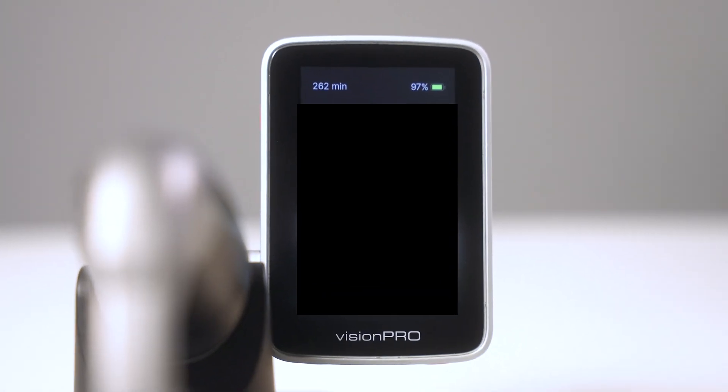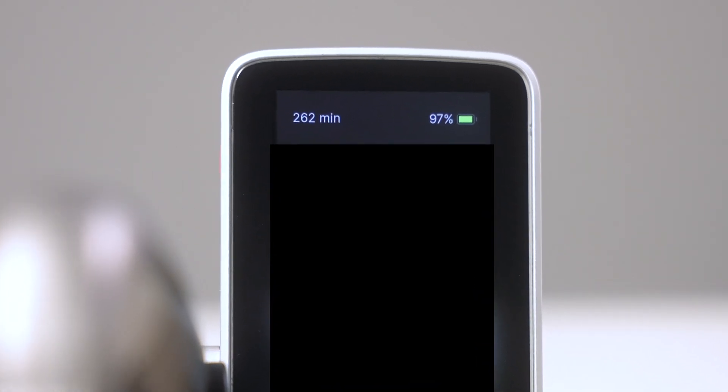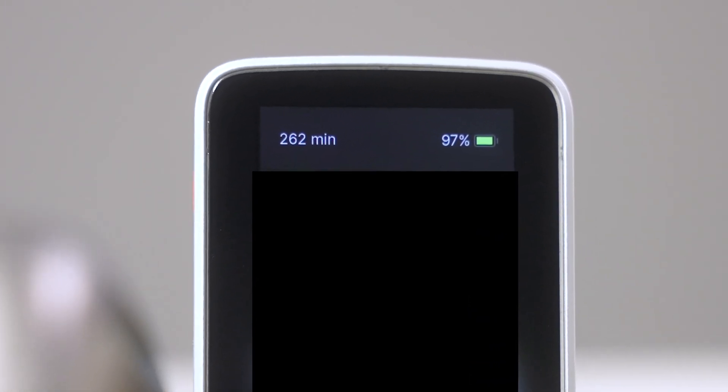For users, it's easy to keep an eye on the remaining runtime while using the Vision Pro. The battery level is continuously displayed in the status bar at the top of the screen, allowing the user to know the exact operating time of the Heine Vision Pro.